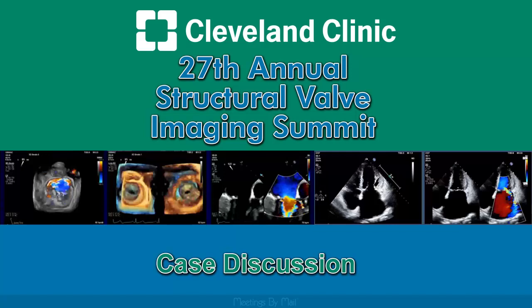Yeah, and that's actually a really good point, because we thought about that during the procedure, and I don't think there's a right answer to this. Our thought process was that if we plug the hole first, then there won't be a risk of tearing the perforation when we are cinching the mitral valve with the clip. But I don't really think that there is a benefit of one way or the other.